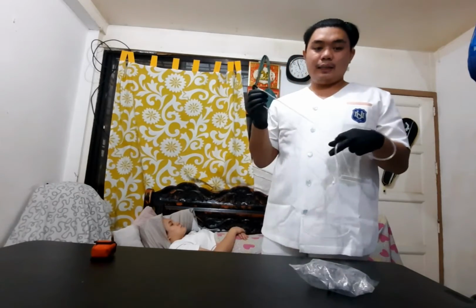Now, the nasal cannula. In this video, I'll be using the nasal cannula. Place the nasal cannula prongs into the patient's nostrils, and then secure the nasal cannula in place by adjusting the tubing around the client's ears and using the slip ring to stabilize it under the client's chin.